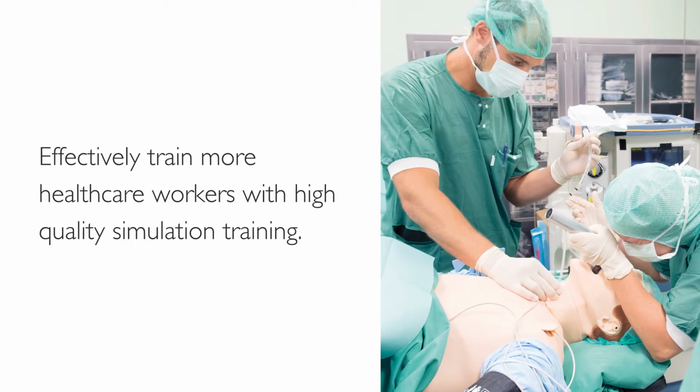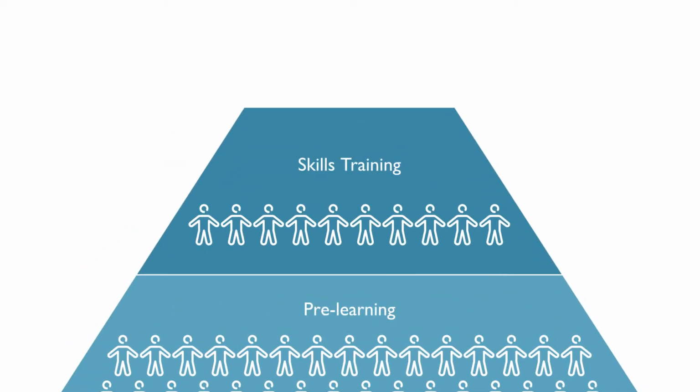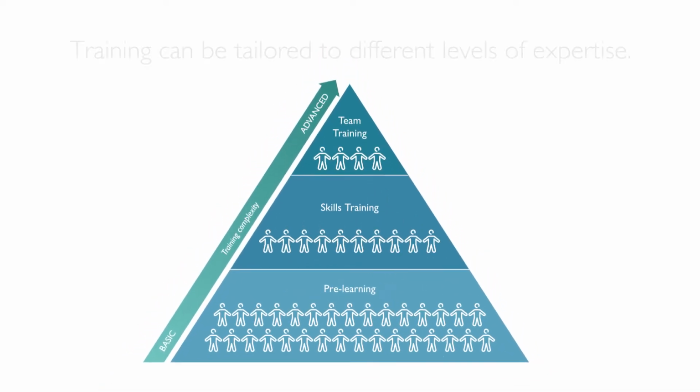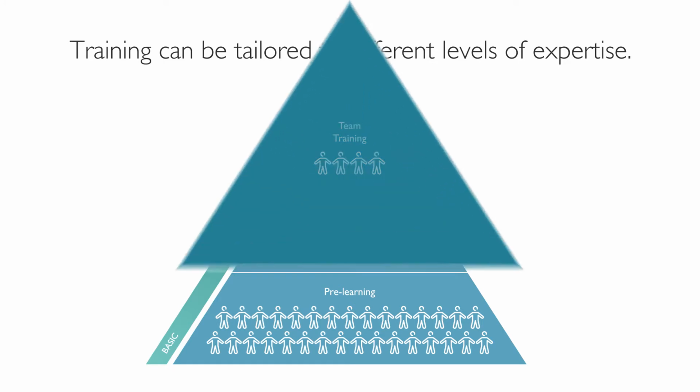High-quality simulation training. Our Respiratory Care Solution is the only training program that offers everything you need to get learners up to speed quickly, from basic to advanced ventilation management and respiratory care. The training can be tailored to different levels of expertise.